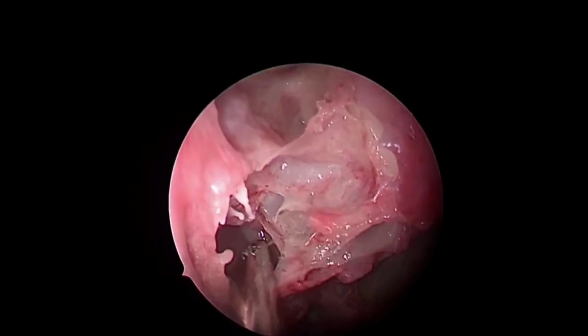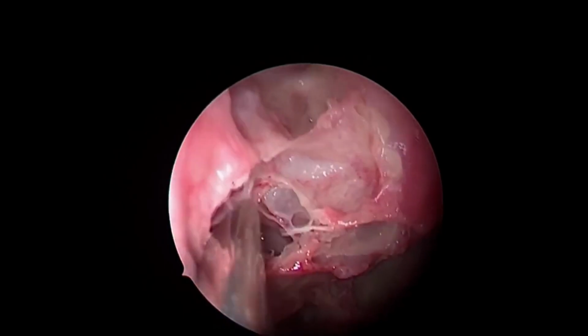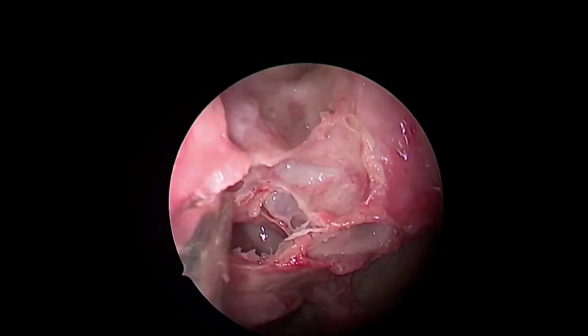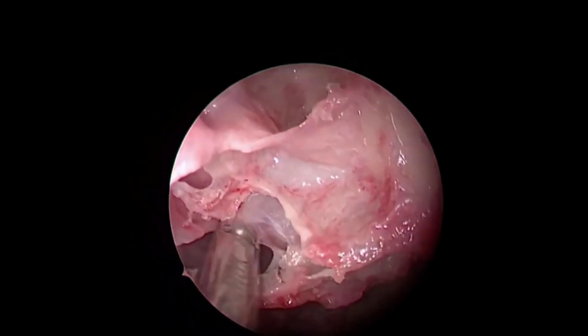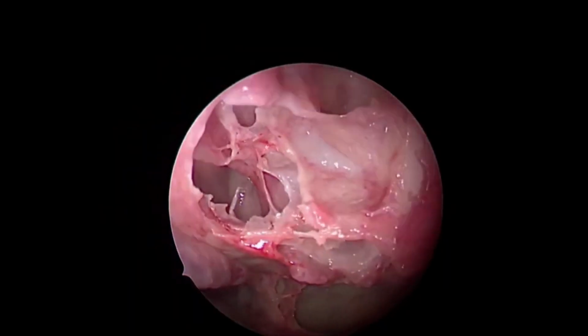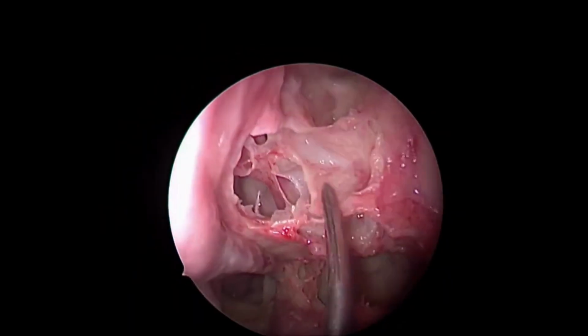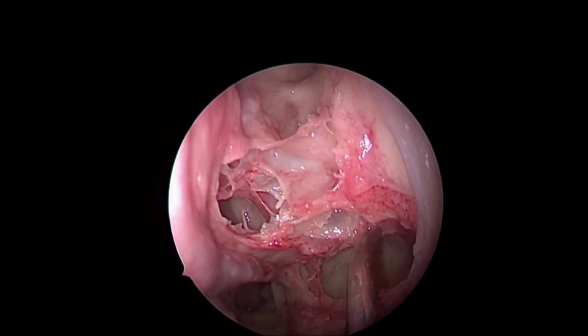I don't intend to do the posterior ethmoidectomy here at this point of time, for the reason that I need certain landmarks to define that I don't go accidentally into the sphenoid and damage everything behind. So what I did was make this opening in the medial part of the ground lamella, at the level of the floor of the orbit.